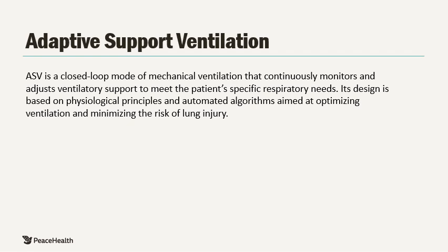Adaptive support ventilation employs a feedback-based control system where the ventilator constantly evaluates patient parameters like tidal volume, respiratory rate, compliance, and resistance. The ventilator dynamically adjusts inspiratory pressure, respiratory rate, and tidal volume to maintain an optimal minute ventilation while accounting for changes in the patient's condition.